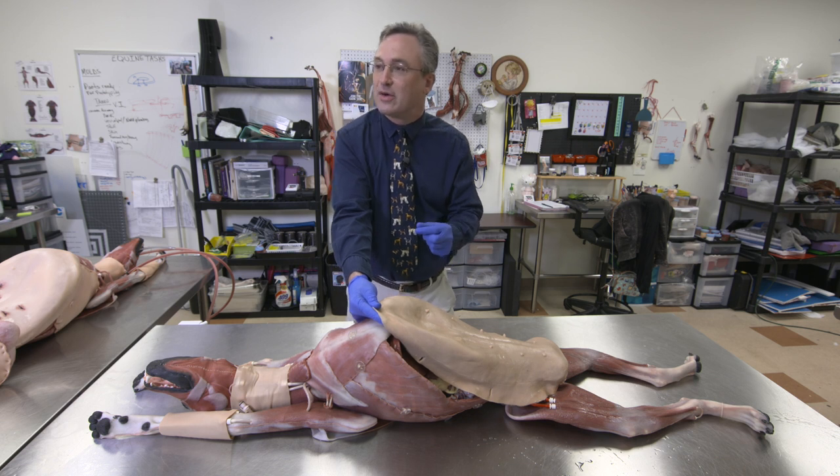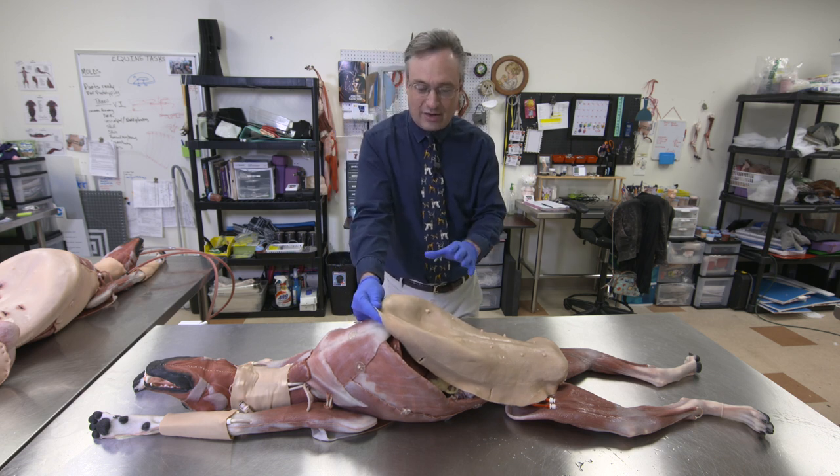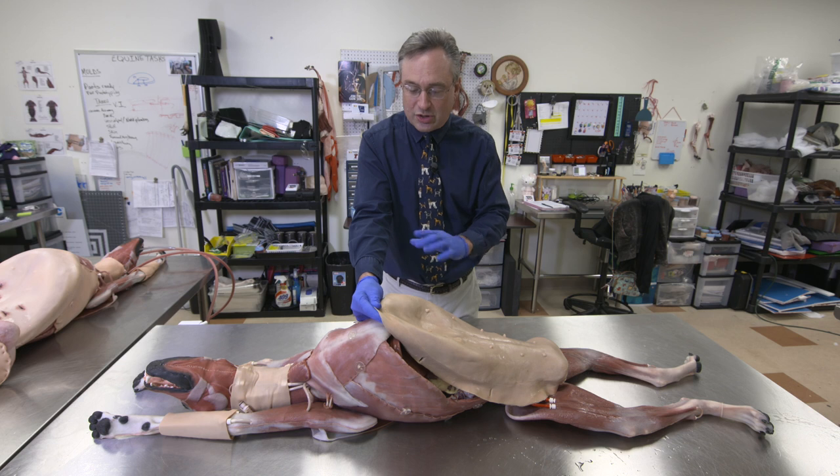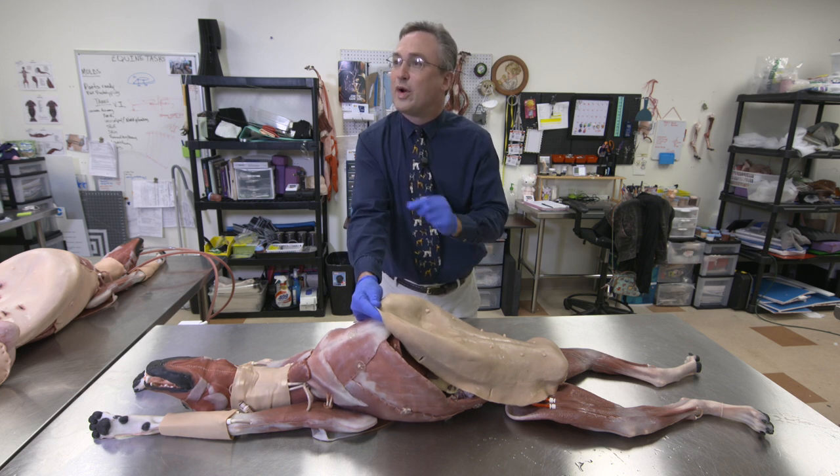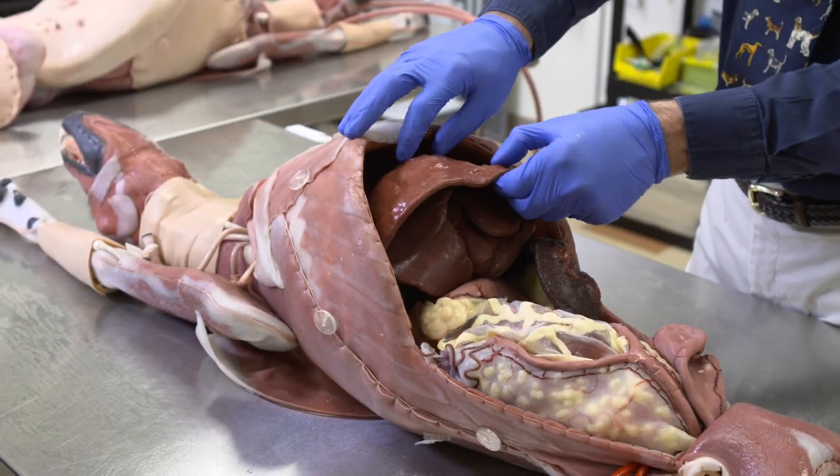Specifically, there are pathologies that we have developed into the dog so that as a good surgeon, you would do a thorough exploration of the abdomen and be able to discern what you're supposed to do. And this is kind of part of the training.